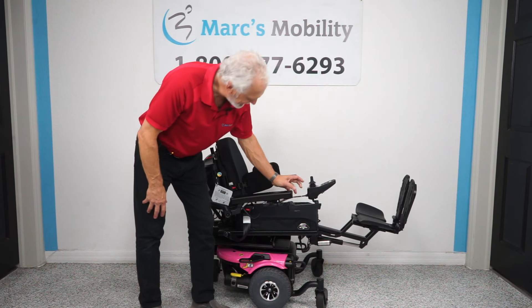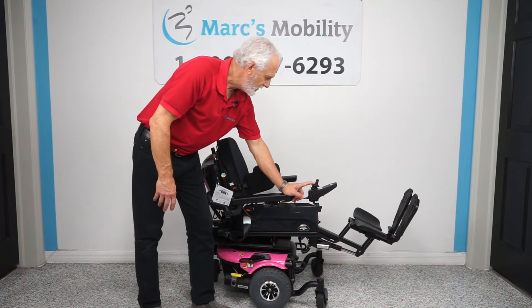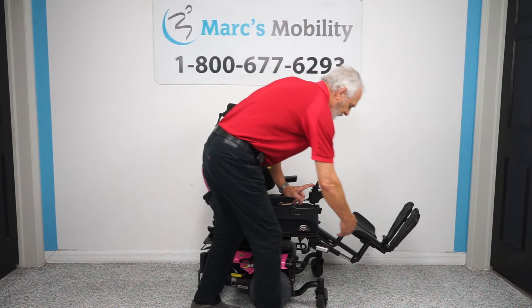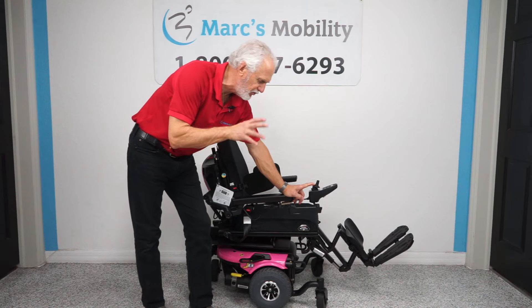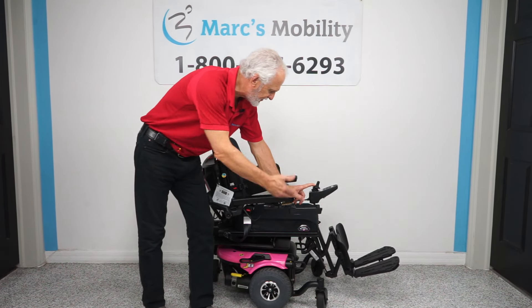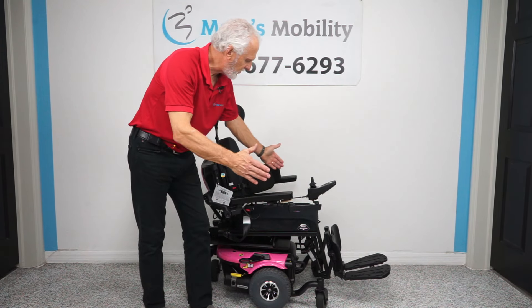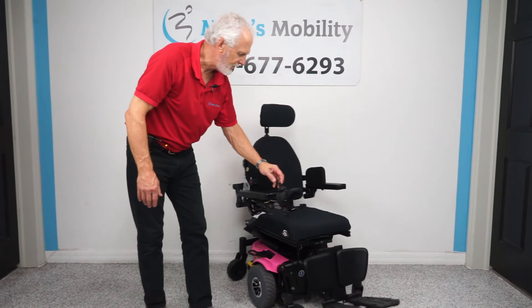I'm going to bring this seat back to flat and then put the legs back down. Remember, these legs are adjustable — if we need them longer or shorter, everything's adjustable in this chair. If you're 250 pounds or less, this is the chair you want. We can adjust the seat, adjust the length, make the seat bigger or smaller.